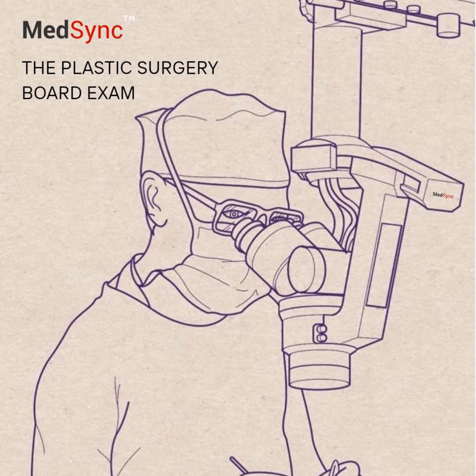Plume evacuation. Yes, especially with ablative lasers like erbium and CO2, which create a plume of vaporized tissue containing potentially infectious particles and chemicals. A smoke evacuator with an ultra-low particulate air, ULPA, filter is essential. And skin cooling. Why is that used? Skin cooling protects the epidermis from excessive heat, reducing pain and minimizing the risk of burns or pigmentary changes, especially when targeting deeper structures. Various methods. Contact cooling with a chilled sapphire or metal tip on the handpiece, cold gel applied to the skin, cold air blown onto the area, or cryogen spray delivered just before or after the laser pulse. The timing relative to the laser pulse is important.